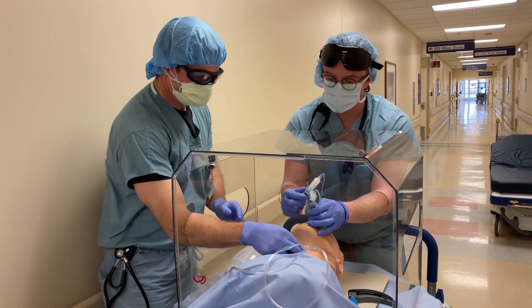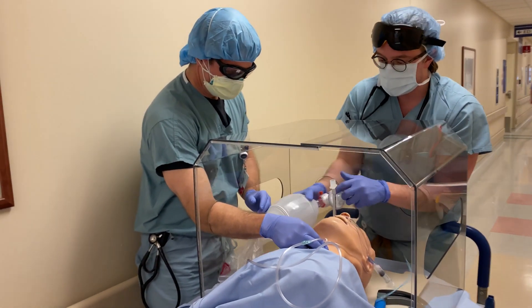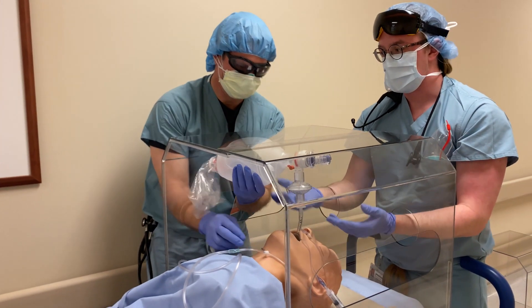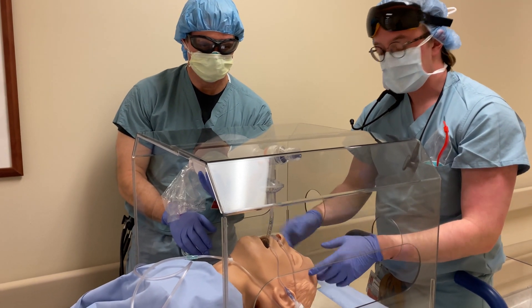Intubate just like that, view's not obstructed, and then you can pass them the bag, you can hook it up, and somebody can bag you. It's a little bit awkward because of the confined space, but it still kind of prevents everyone helping from being exposed. So that's pretty much it.